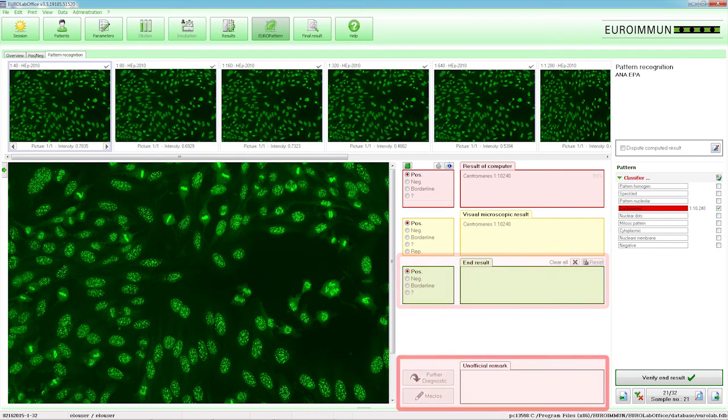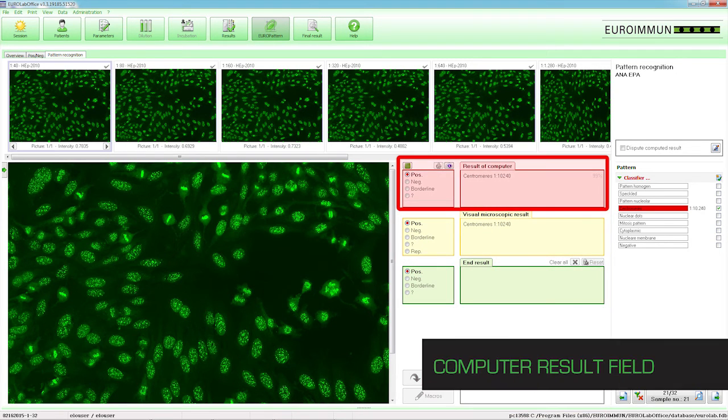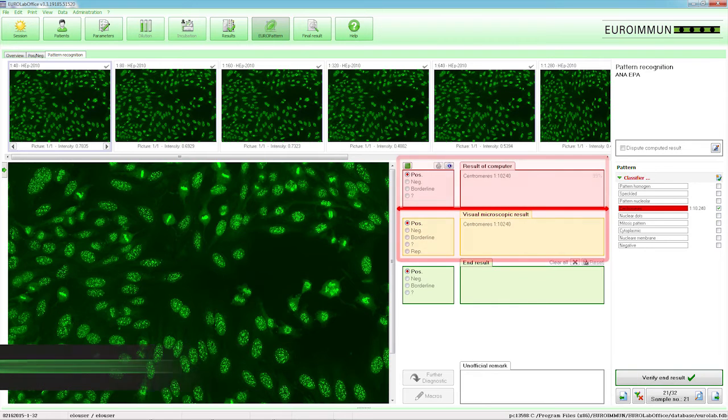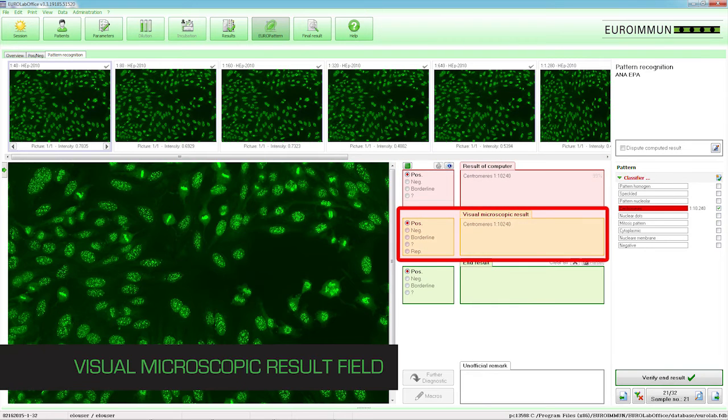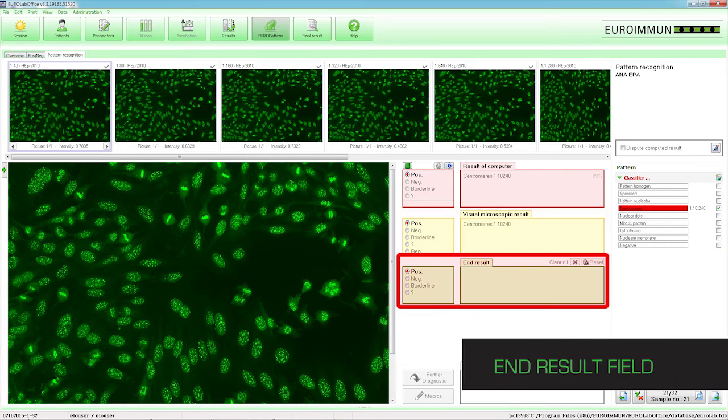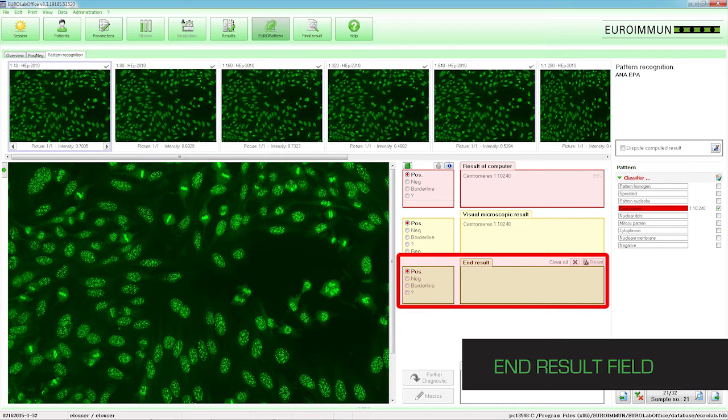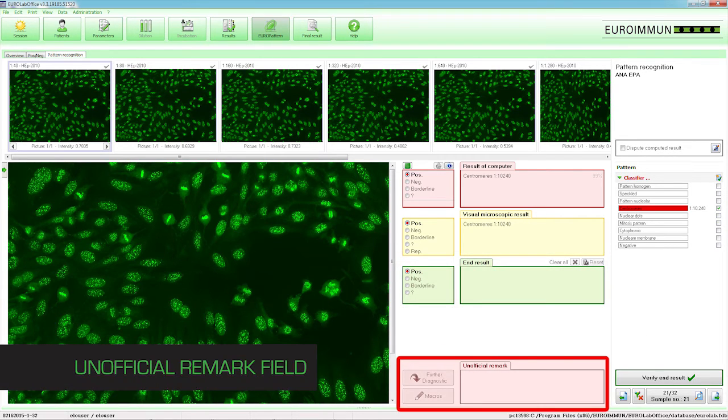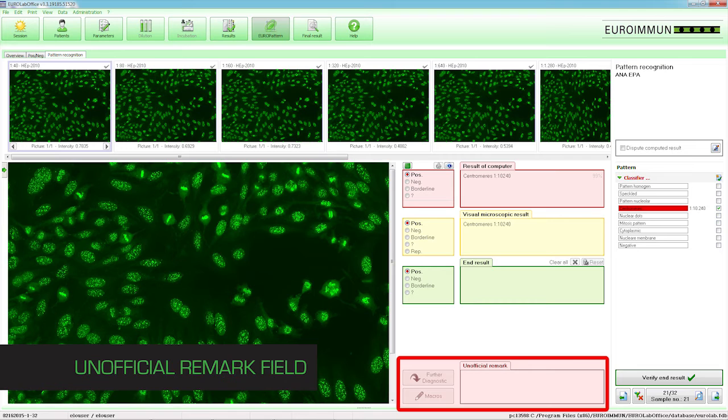The Computer Result field displays the automated result generated by the Europattern classifier. The Visual Microscopic result field displays the result interpreted by the laboratory technologist. The End Result field is populated upon verification by the laboratory technologist and displays the final results. The Unofficial Remark field is for internal comments only. This information does not get sent to the LIS system.